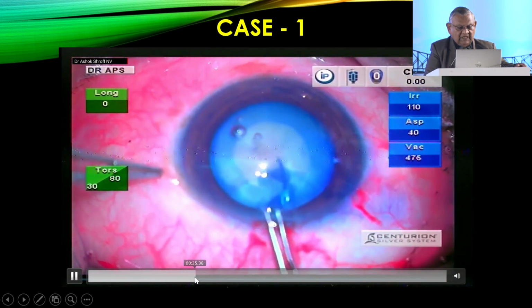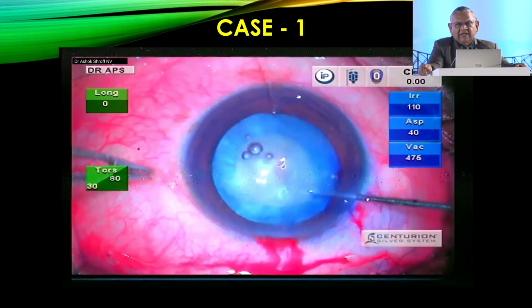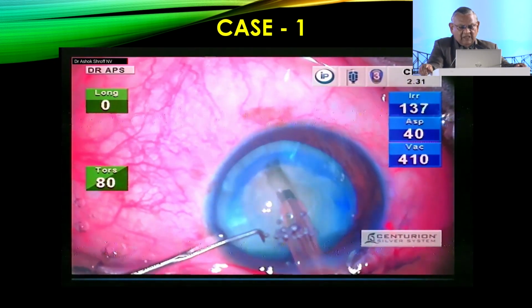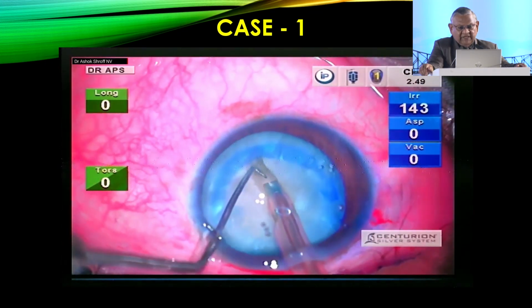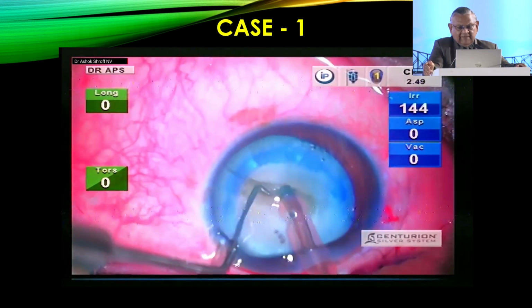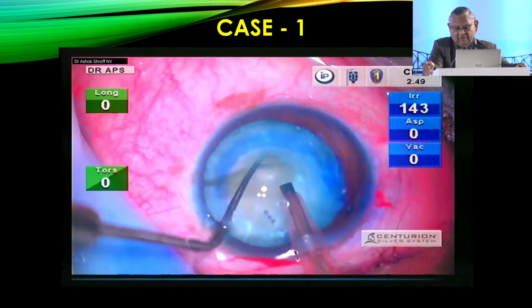Once it is completed, there is hardly any need for any hydro. You can rotate it. And as Dr. Harbansh has mentioned beautifully, you have to make a trench in the center. And you can see there is a sharp chopper. And then here, because the nucleus is not that very hard, of course, they're very soft too.